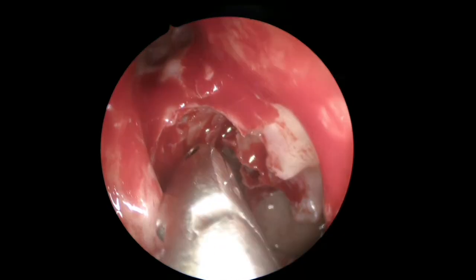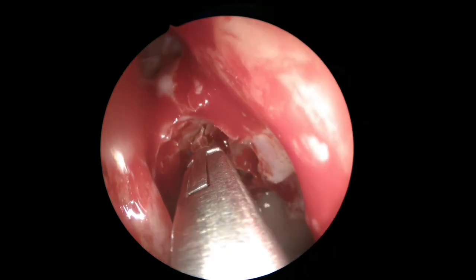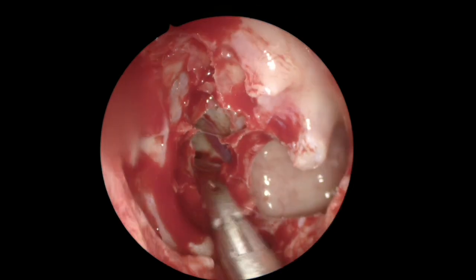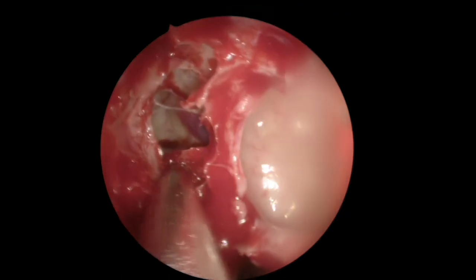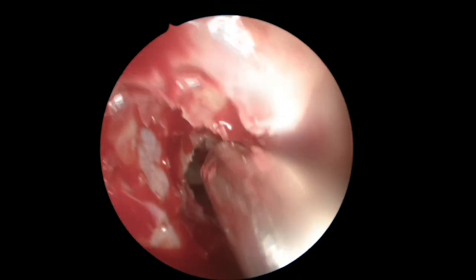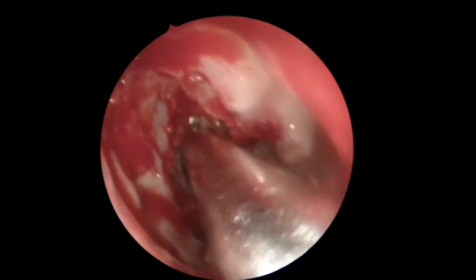You can see the change in direction of the skull base here. I believe we've addressed this posterior ethmoid cell and you can see inside, in the superior part of the cell, the skull base. We're going to clean up bone chips, and the debrider can also remove small tips of bone that may be obstructing your view or preventing you from advancing.